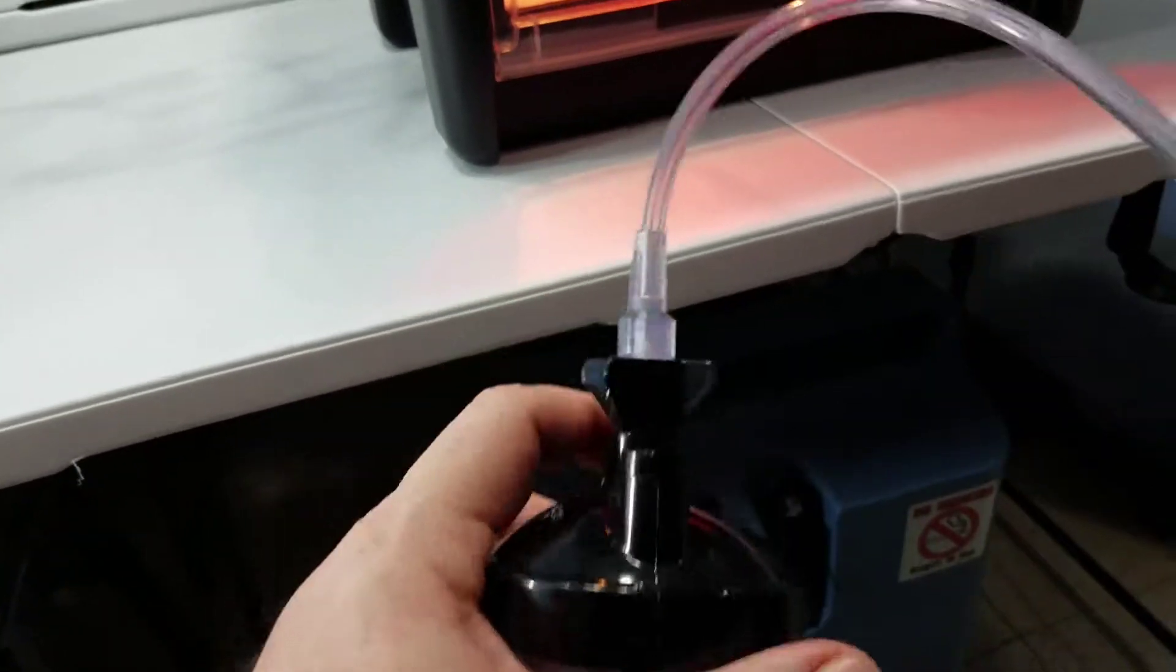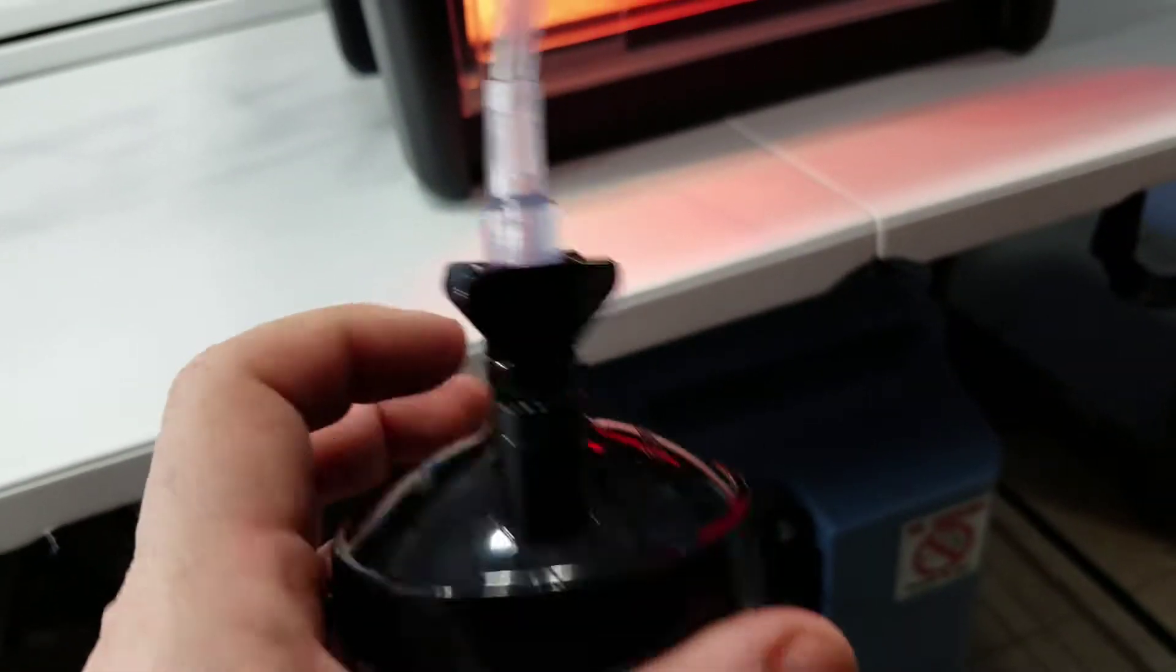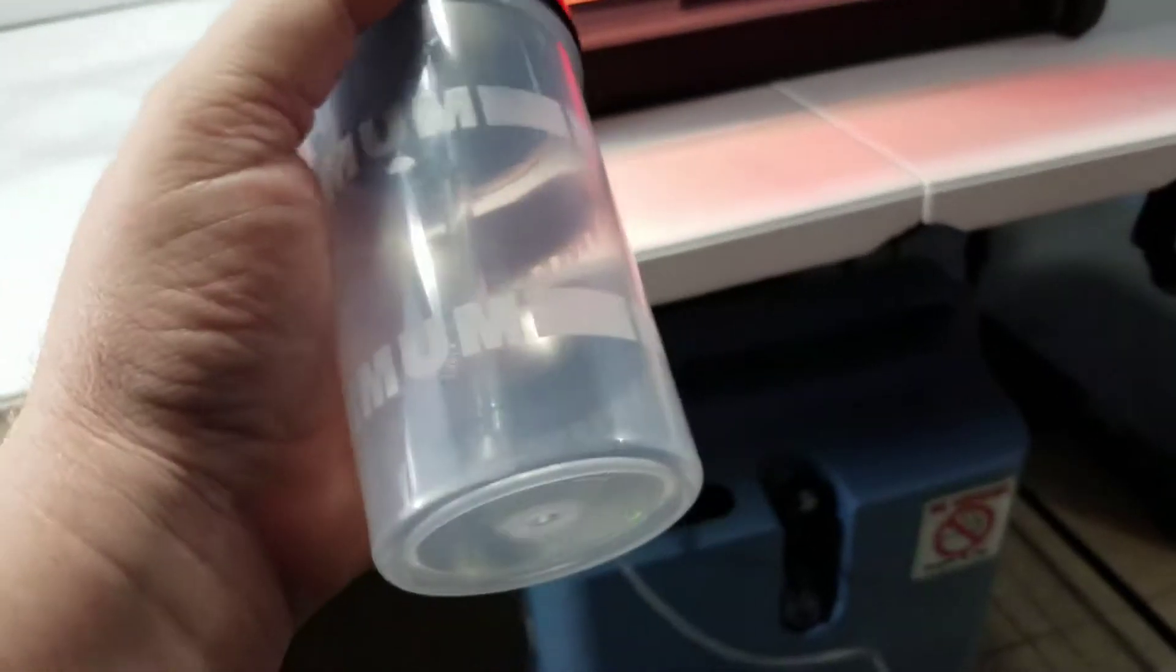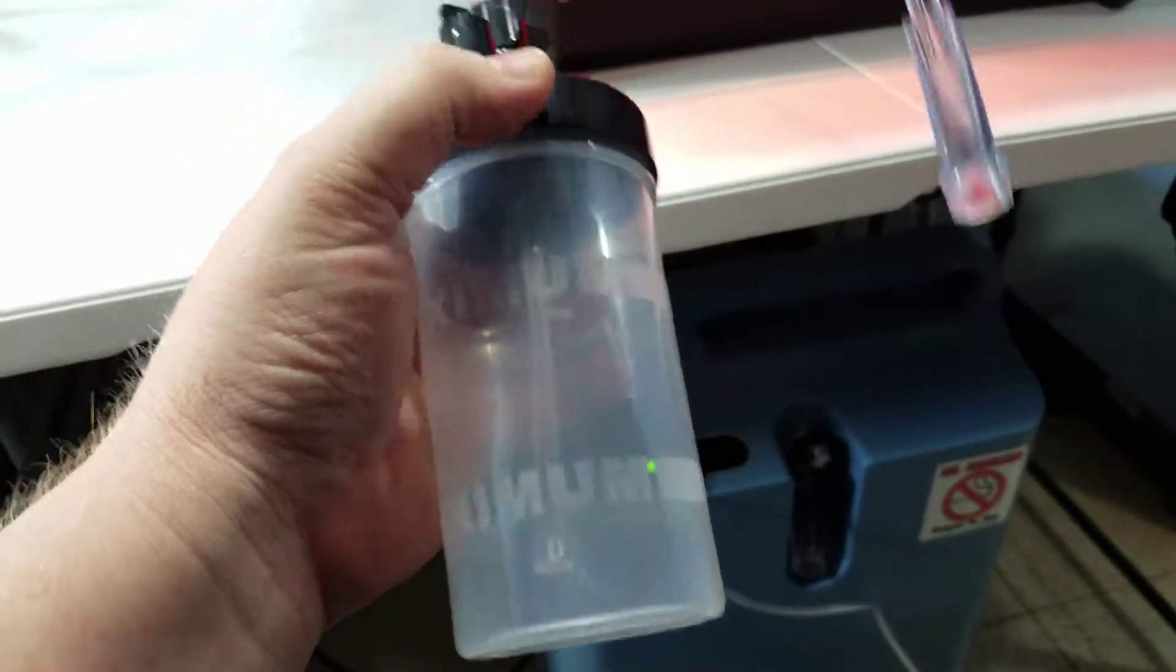First thing you're gonna do is unpackage it. You're gonna see a tube like this with a threaded end that goes into the top of the bubbler cup, and you're gonna see a cup like that. I'm gonna fill this thing up with water.